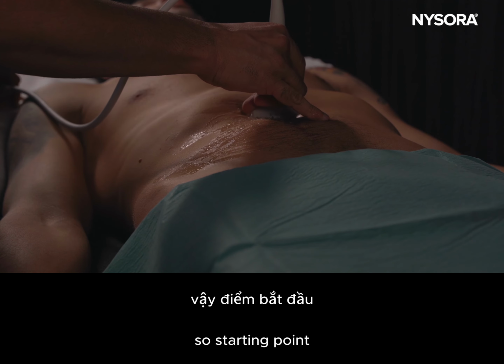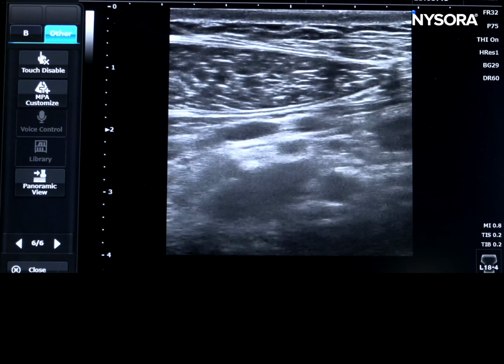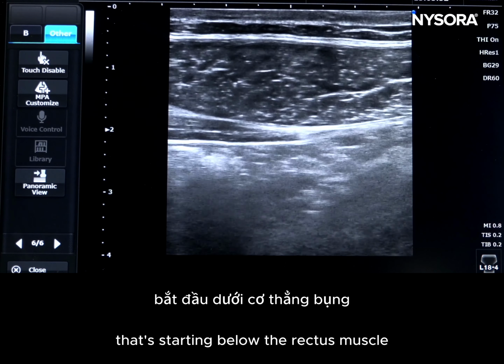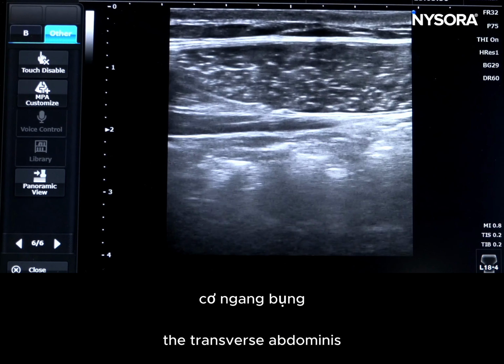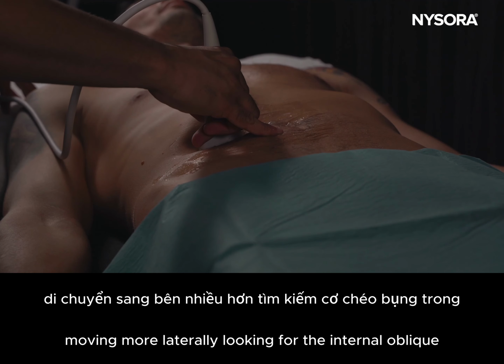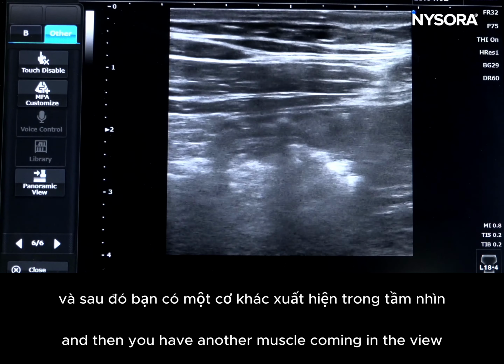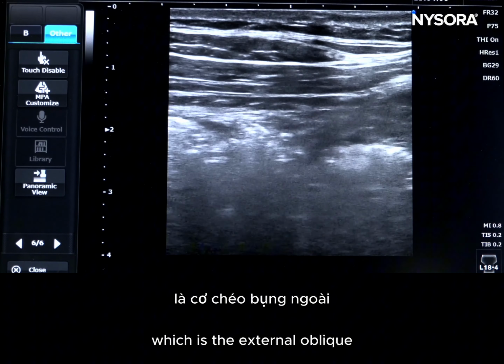So starting point, a bow tie sign with the rectus muscle along with the rectus sheath, moving the probe laterally, looking for the first muscle that's starting below the rectus muscle, the transverse abdominis, moving more laterally, looking for the internal oblique, and then you have another muscle coming in the view, which is the external oblique.